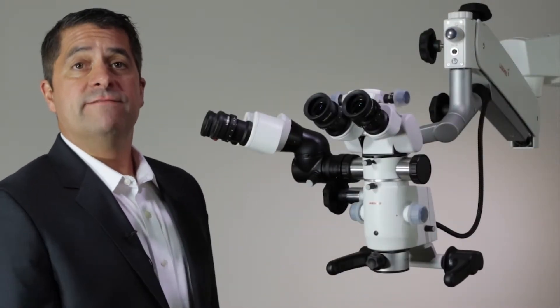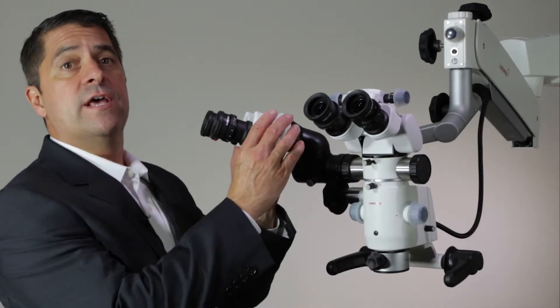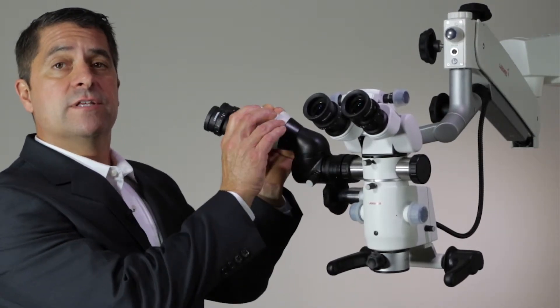The assistant viewer bridge allows a second viewer to observe through the microscope. The assistant viewer can be positioned at various locations relative to the primary user.